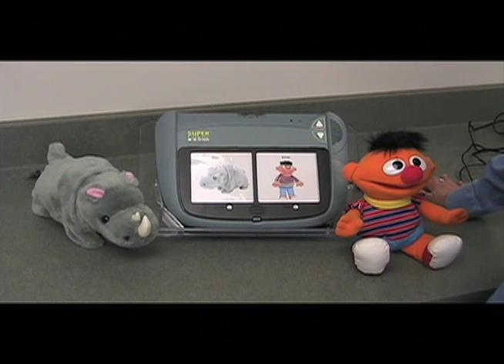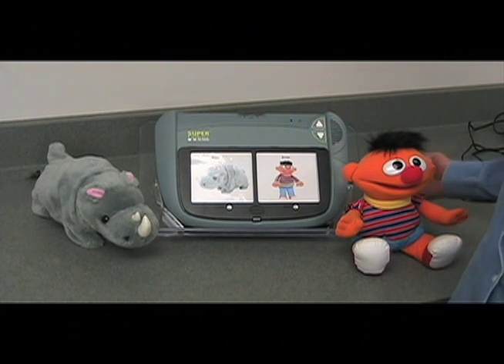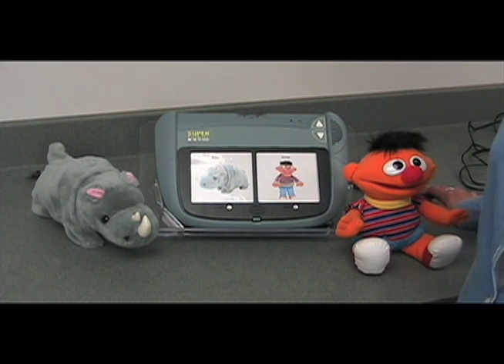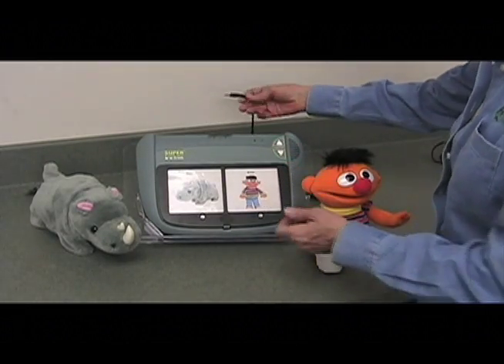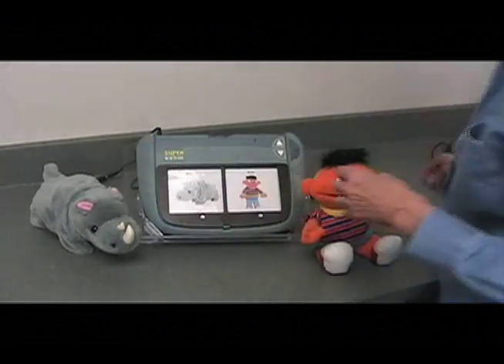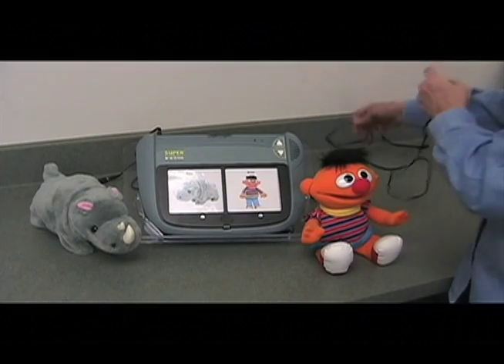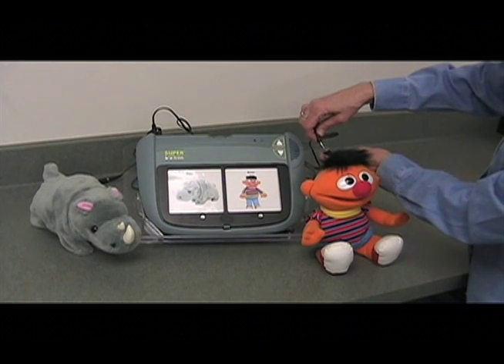The SuperTalker has a toy and appliance jack that will let you operate toys that have been adapted for switch input, or even electrical appliances if you're using the AbleNet Power Link. But today we're going to operate a couple of battery-operated toys. To do this, you use the cord that came with your SuperTalker, plug one end into the toy and appliance jack, the other end into the toy you want to make go. We're going to use two toys today to correspond with our messages. So we take the second cord, plug it into jack number 2, and the other end into the second toy.